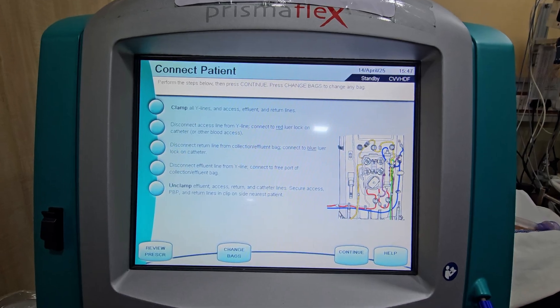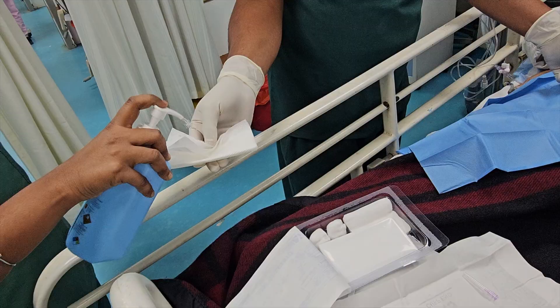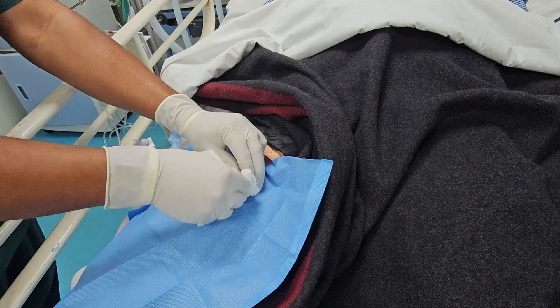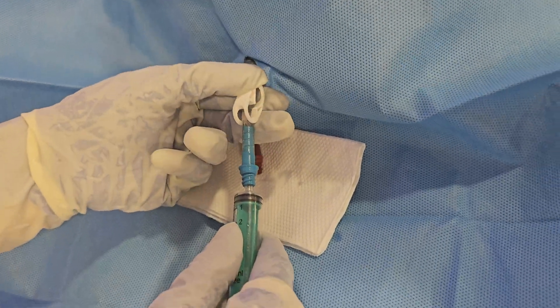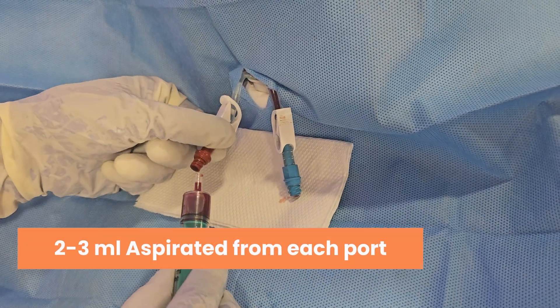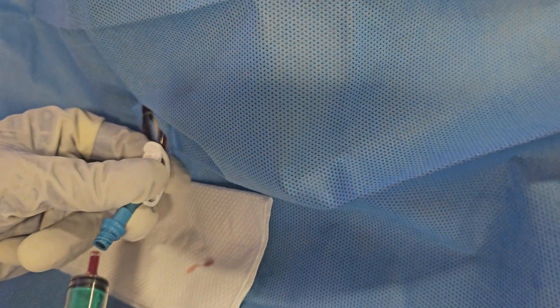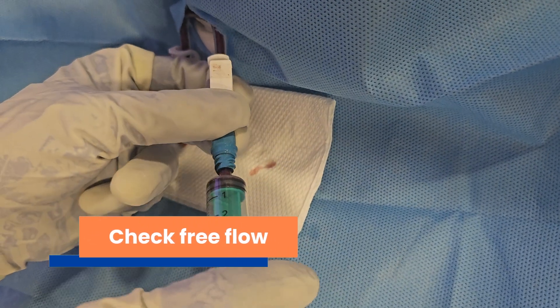Connect to patient. Dialysis lines cleaned with chlorhexidine wipes. 2–3 ml of blood aspirated from each port to remove any clot or air, and then discarded. Free flow ensured by aspirating and pushing blood.